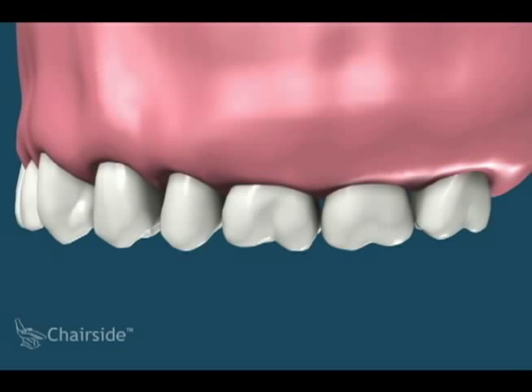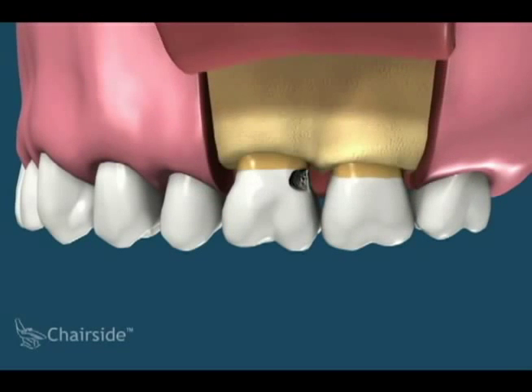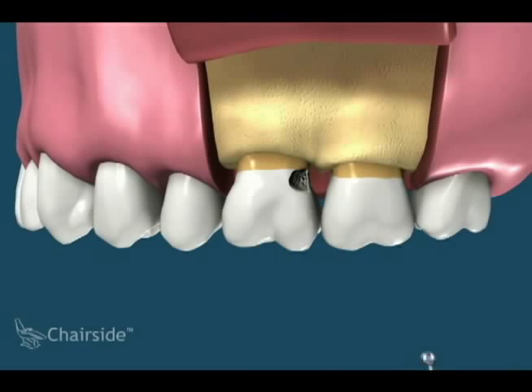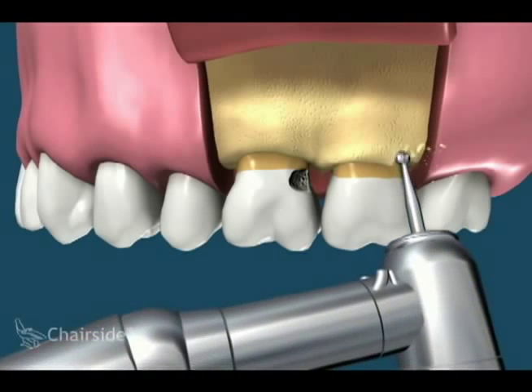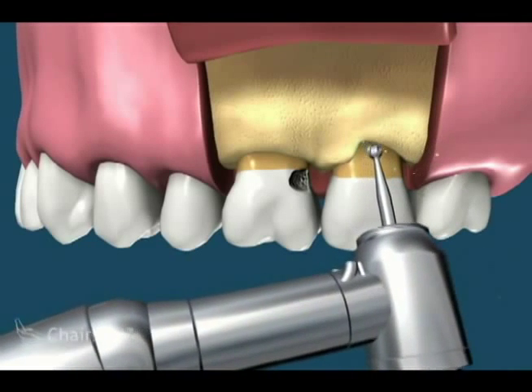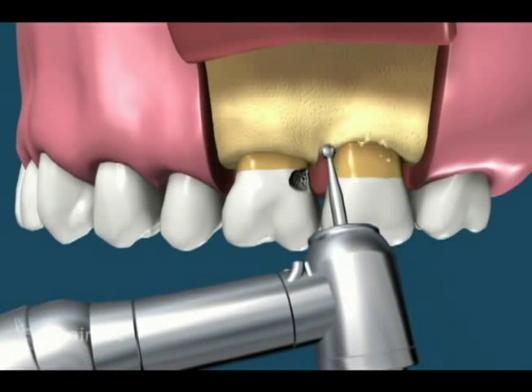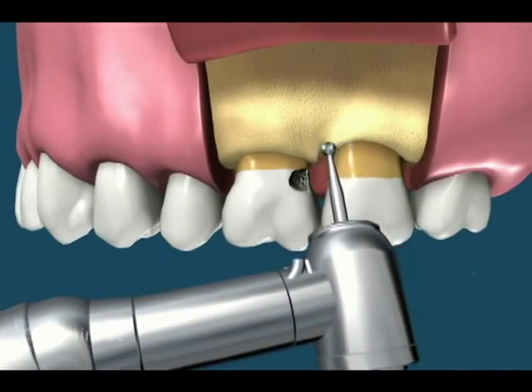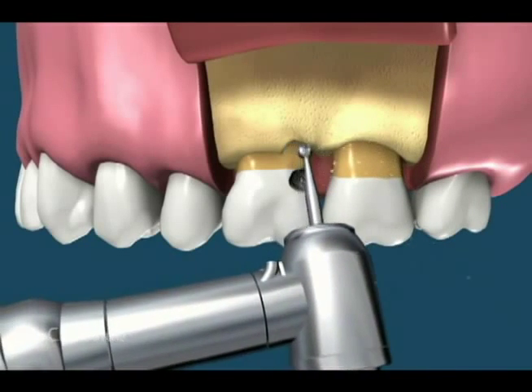A solution for this problem starts with the raising of a flap. Different instruments, including the dentist's drill, are used to reduce the bone height, and this new bone architecture is prepared to support the gums in a lower position on the root of the tooth.